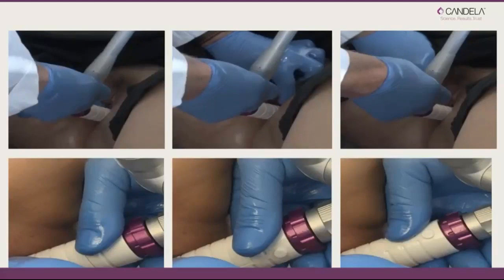Now, I have another question. What parameters would I use for a female patient aged 45, skin type 3 or 4, thin skin without scars, and only slight pigmentation and wrinkles? And what I will say for this is that I would, first of all, discuss with the patient the balance between efficacy and recovery time.